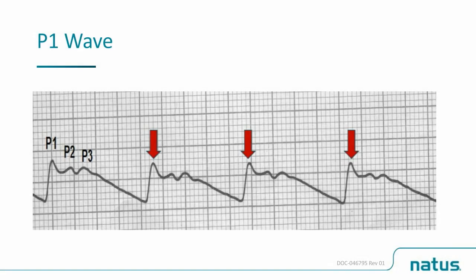P1, the first wave, should be the peak wave. It is the big push of blood flow into your brain. Most of this wave originates from the choroid plexus inside of the ventricles. Because the P1 wave is associated directly with blood flow, you can see a peaked P1 wave with a high systolic blood pressure and a dampened P1 wave with a blood pressure that is inadequate.